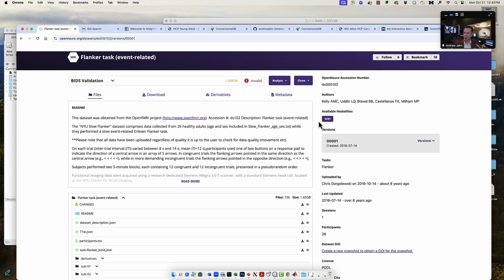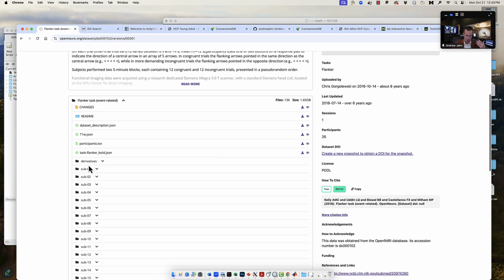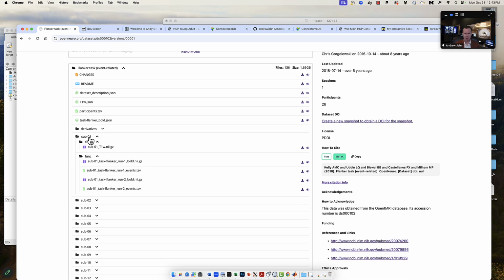Let's say that you published the flanker task, some fMRI study of the flanker task. Where do you see related bold signal in the brain in response to the flanker task? So when somebody uploads their data, they put it into this so-called BIDS format, which again is very, very useful. It's a relatively new trend, which I think is going to help advance the field immensely. So notice every subject has a unique identifier starting from sub-01 to however many subjects you have. And then subfolders like ANAT and FUNC, storing things like your anatomical data, for example, and functional data as well.